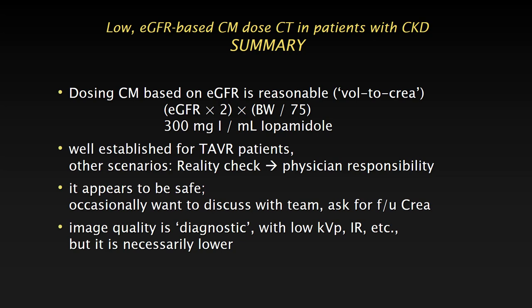So the image quality, I do think it is safe. The image quality, I would argue, is diagnostic, and it gets better with low kVp and iterative reconstruction, and the Force certainly is the most powerful machine that we have, and we really tease out every little piece of technical tricks that we can from this machine. But you still have to keep in mind the image quality is still not the same as a full dose contrast scan. So that's something you need to account for.